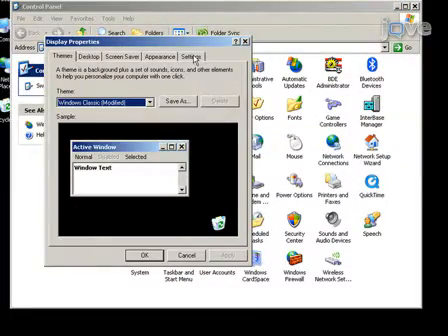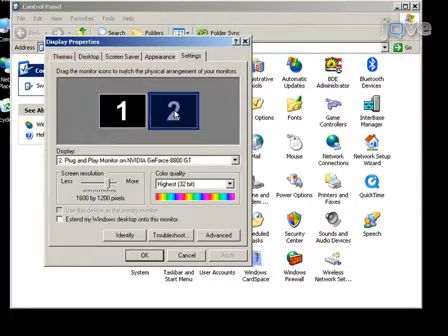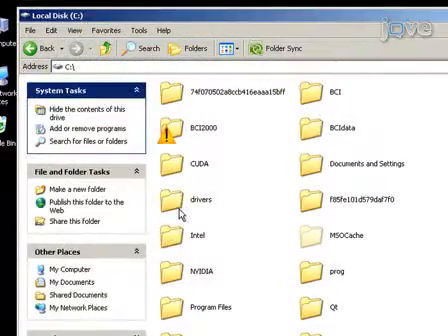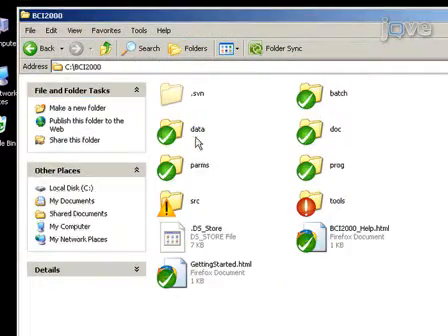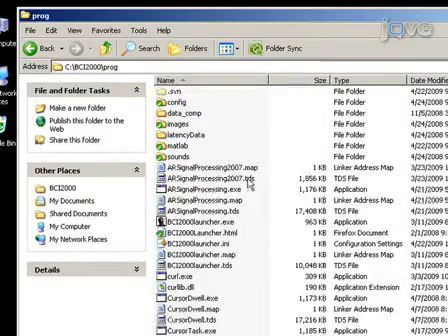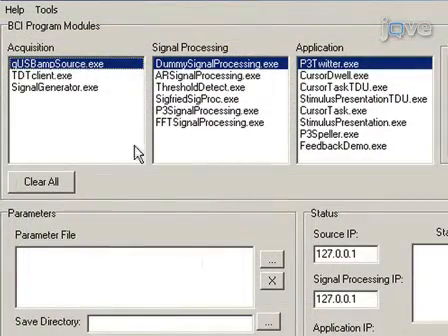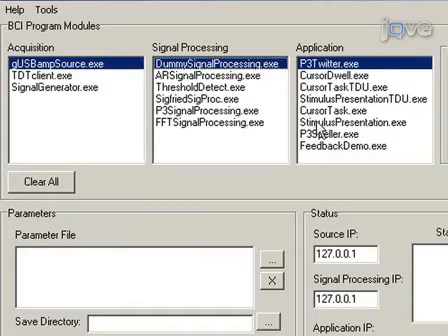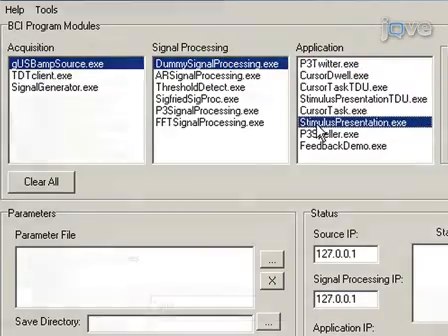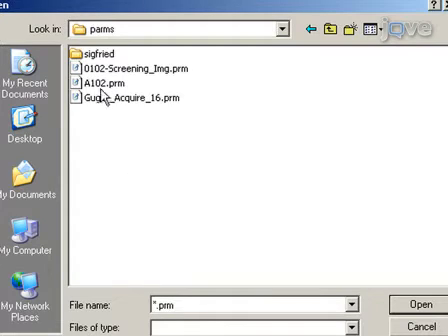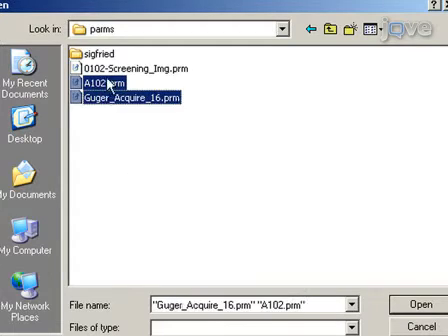To get started, configure the computer system for dual monitor mode. Start BCI 2000 from the BCI 2000 launcher by selecting your amplifier source module, the dummy signal processing module and the stimulus presentation module. Add the parameter files for your subject, the amplifier and the motor screening tasks, which you should configure ahead of time.